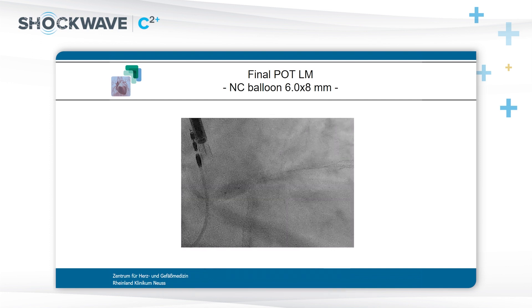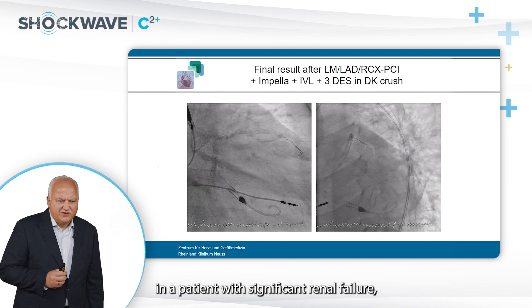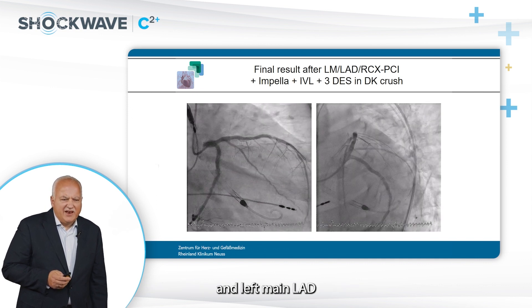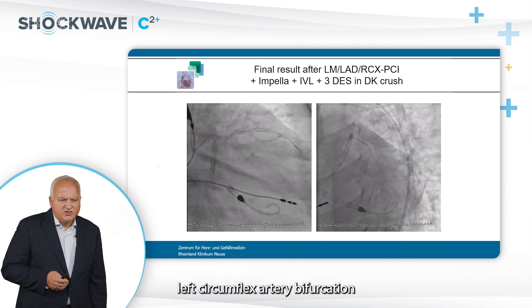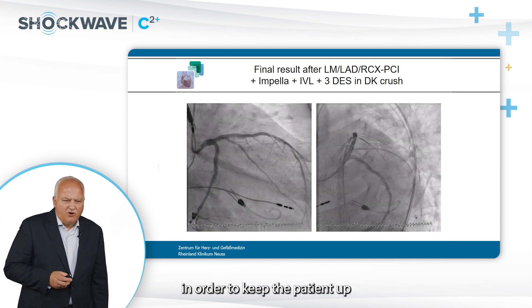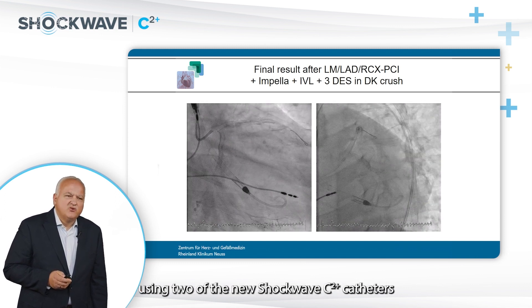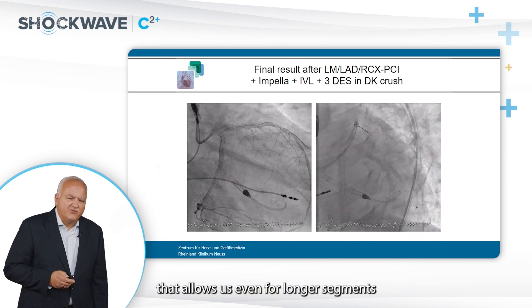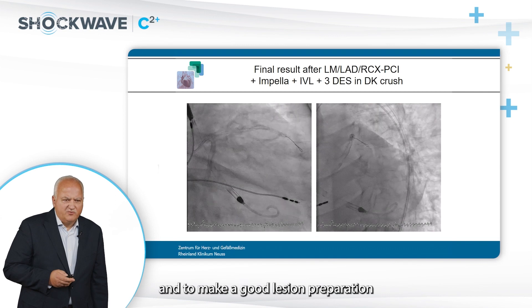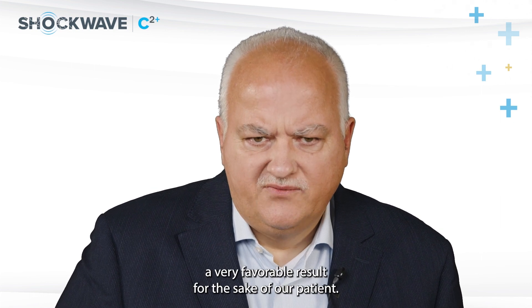The final maneuver, as always in DK-Crush, is a final POT maneuver in the left main with a 6.0 mm balloon. This is the final result achieved in this quite complex case — a patient with significant renal failure, impaired left ventricular function, and heavily calcified left main, LAD, and circumflex artery bifurcation stenosis. We performed a DK-Crush procedure with Impella support and very effective lesion preparation using two new C2-plus catheters, achieving a very favorable result for the patient.